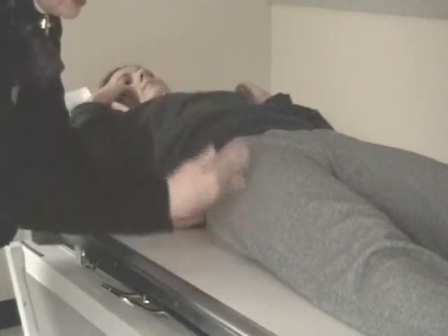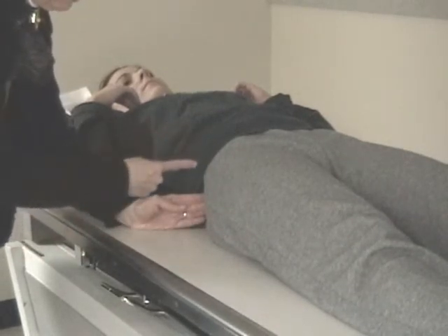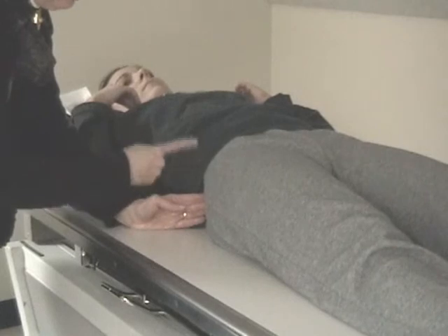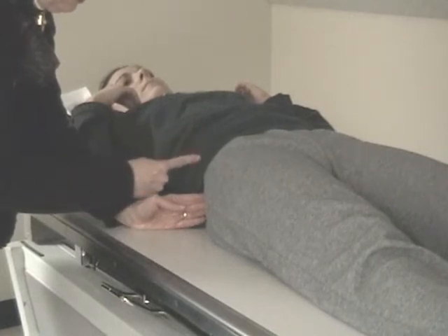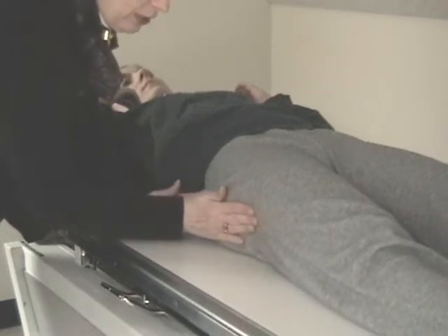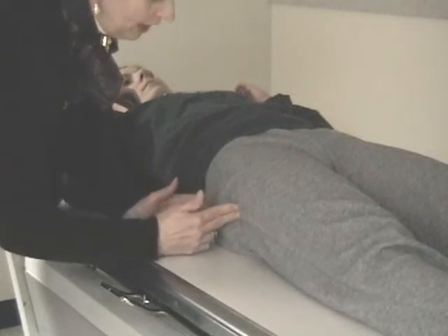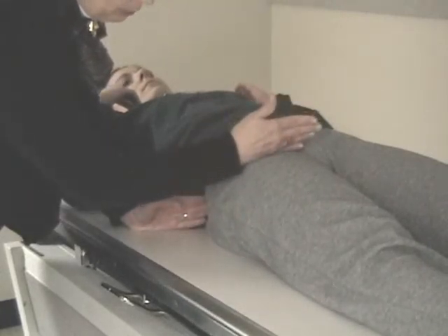So I'm going to find that. If you cannot see or palpate the inferior borders, all you have to do is put the film's edge 2 inches above that iliac crest. Okay? I can palpate for the trochanter on the side here, and I feel it right there. The trochanter is at the level of the pubic bone.